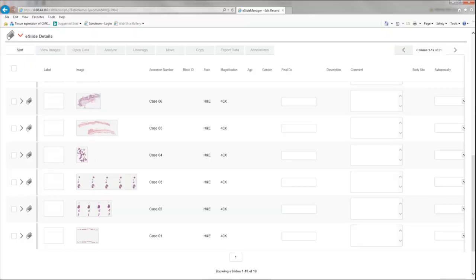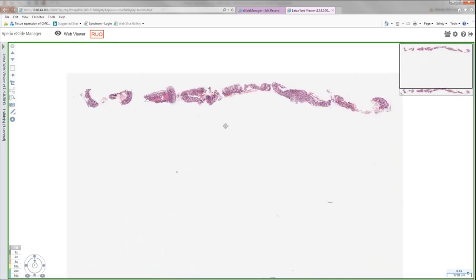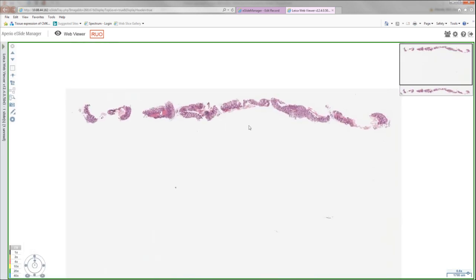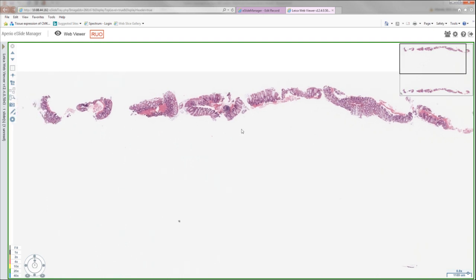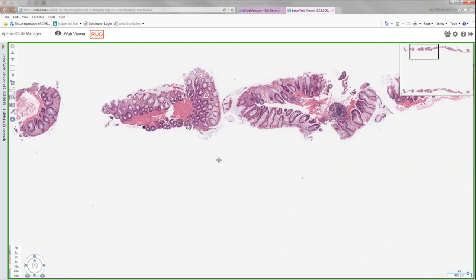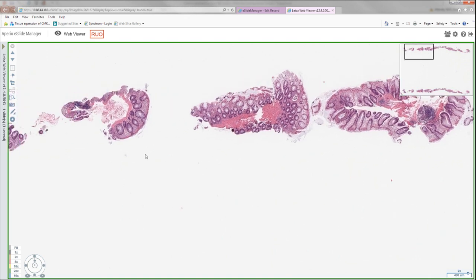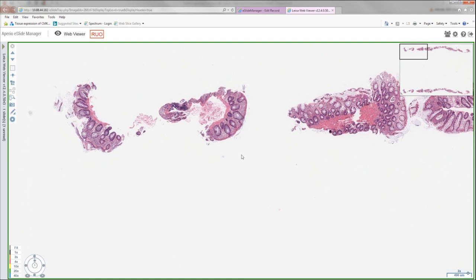And let me pull the scan slide. So this was a 45-year-old patient that came to the clinic with a history of 2 weeks of diarrhea after traveling. It wasn't going away. They decided to do an endoscopy. There was some mild erythema, but nothing very significant. So they took random biopsies.